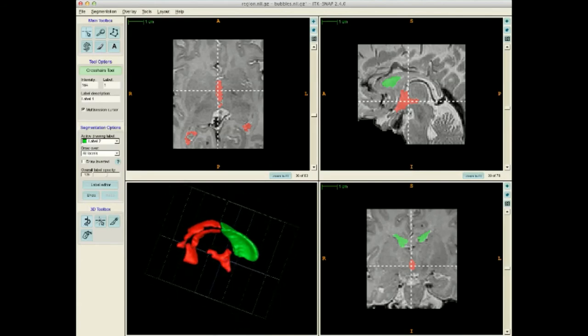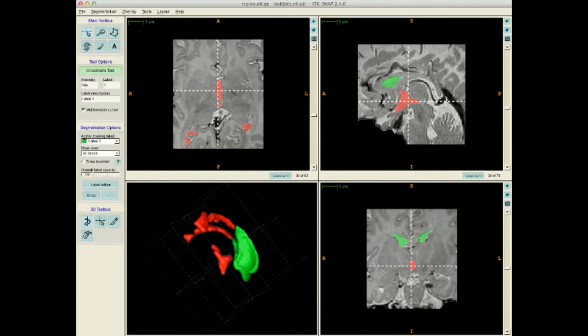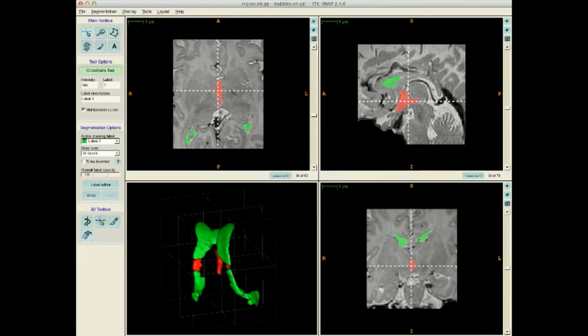So then you do the second cut plane. And you can see here the arrow is facing down. So you have to choose which side of the cut plane you want to apply this label. But here it's probably the wrong side. Then you just reverse the order of your clicking. Just do the other side, and that will be fine. Accept. Then update mesh. Then click back.